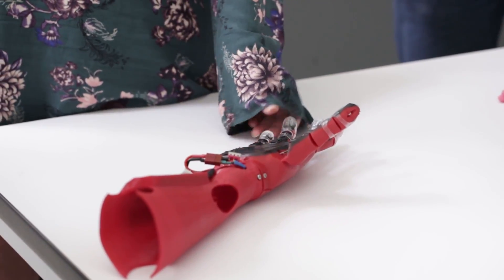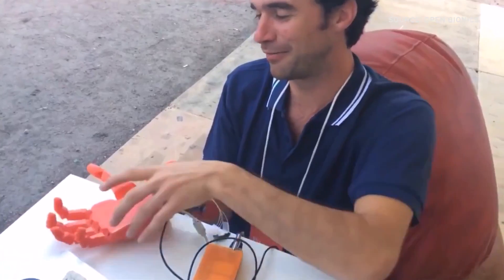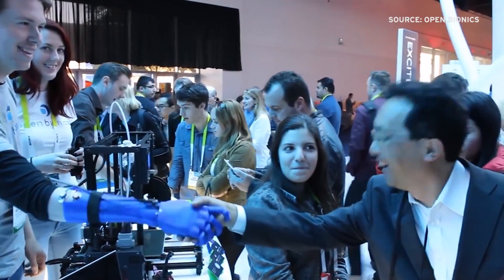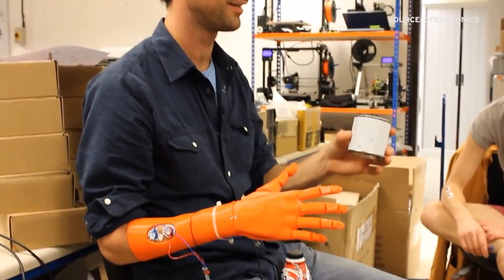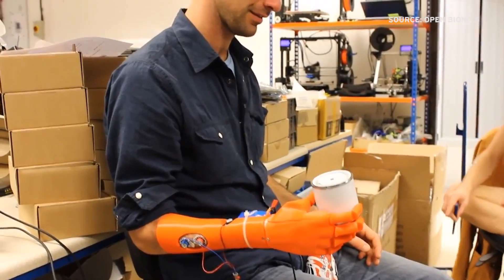What other types of things can these prosthetic hands do? We can do fine grip patterns like a pinch grip — very gentle or quite firm — so they can pick up all sorts of different objects. The kinds of things amputees request are holding a pint of beer, tying their shoelaces, and being able to hold a cup of coffee.